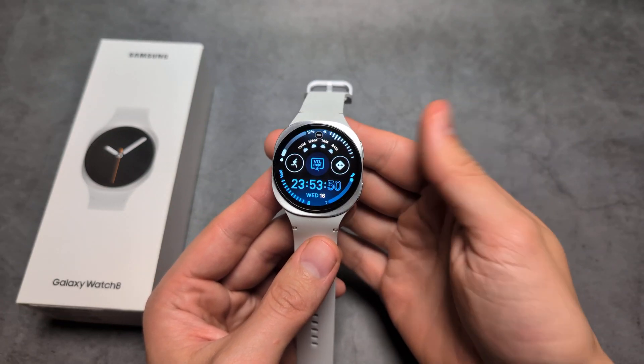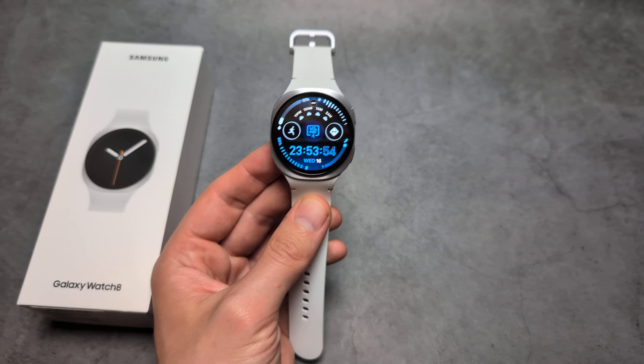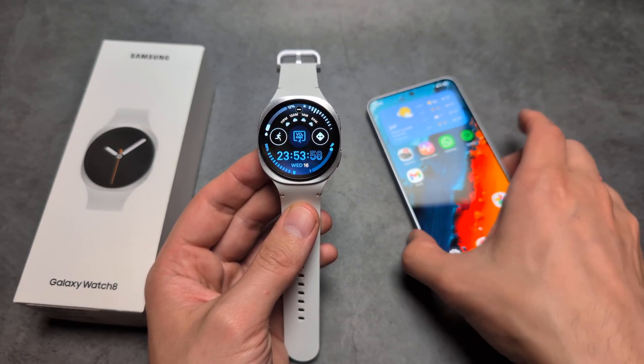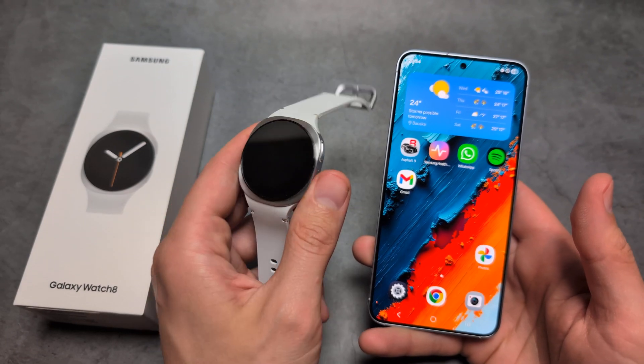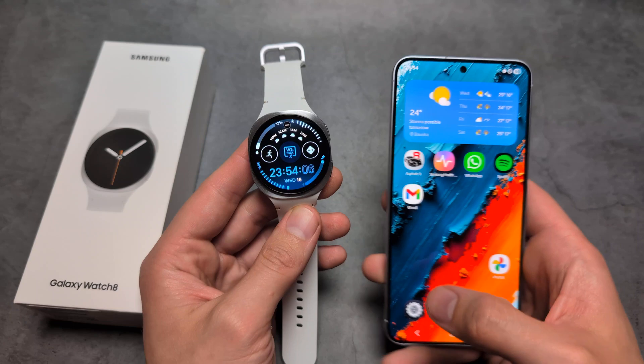Are you wondering if we can do ECG with the new Samsung Galaxy Watch 8? I have some great news. If you pair your smartwatch with a Samsung phone, you will be able to use this function. But if you pair with another Android phone, you won't be able to get this feature. So it only works with Samsung phones.